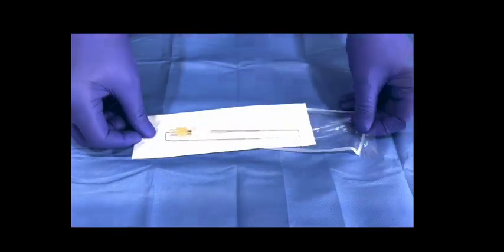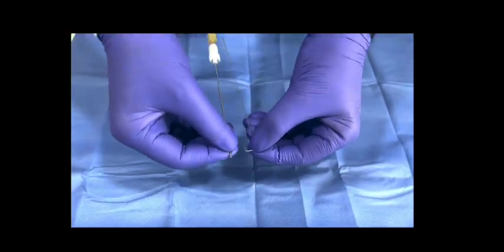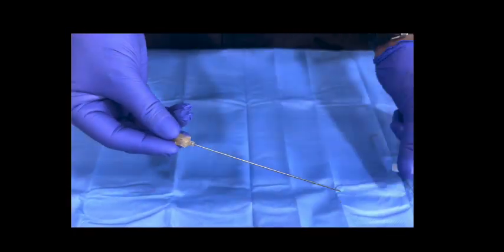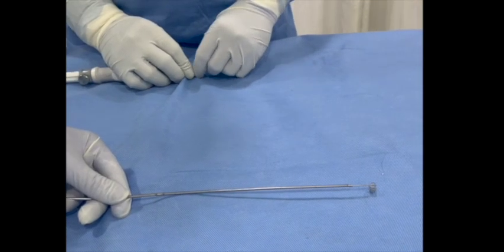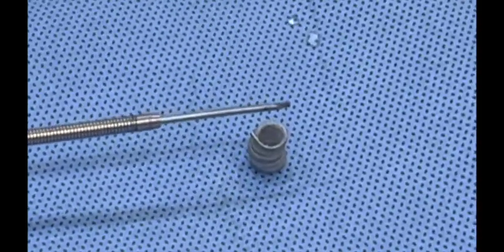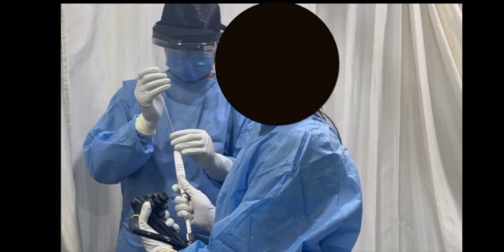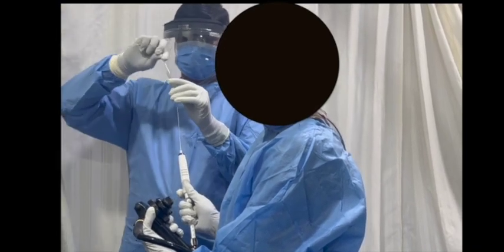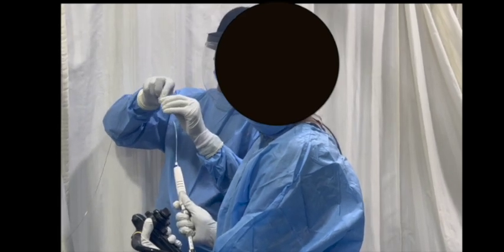The coil loader has an integrated coil within, and this is how it is separated from the assembly. The ex vivo clip demonstrates coil deployment through the FNA needle and the appearance of the coil. Coils have microfibers that help in scaffolding of the glue. All aseptic precautions were taken during the procedure. The coil loader is then attached to the FNA needle, and with the needle stylet, coils are loaded within the needle.